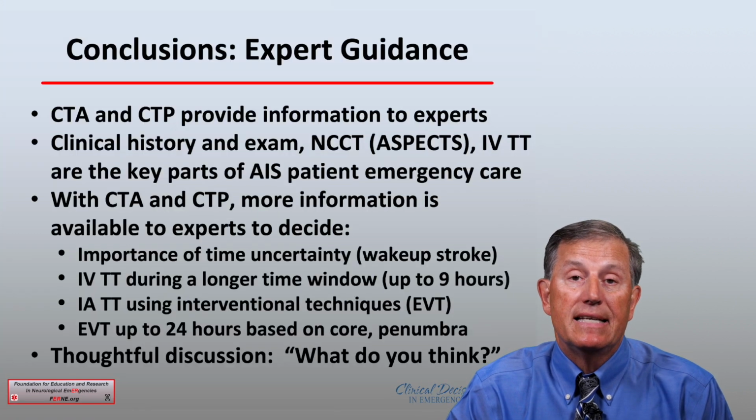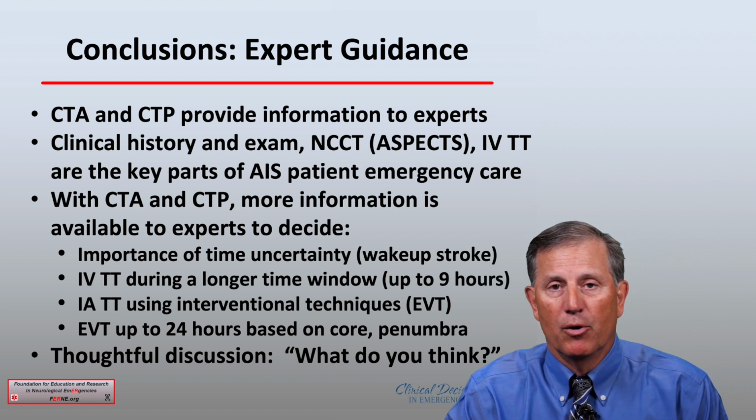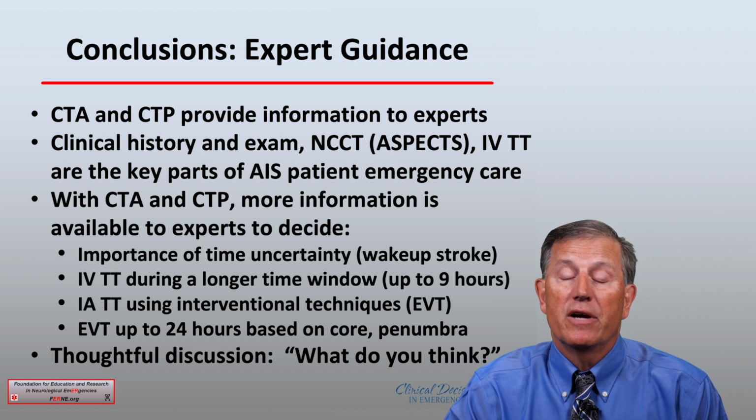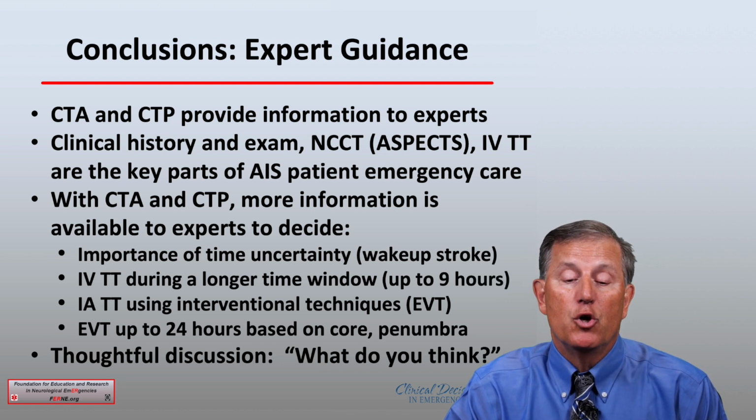We know that CTA and CTP provide information to experts, not the online emergency physician or other provider. We know that the clinical history and exam and the non-contrast CT with the ASPECTS score and IV thrombolytic therapy are the key parts of acute ischemic stroke patient emergency care.